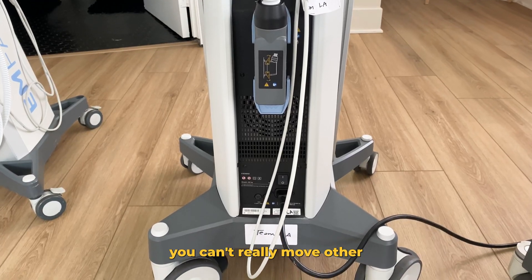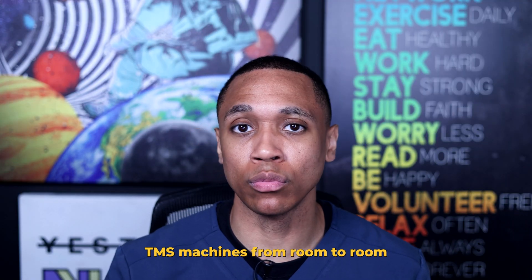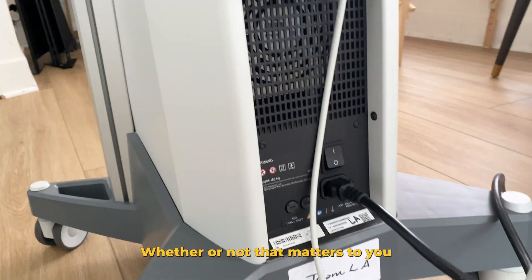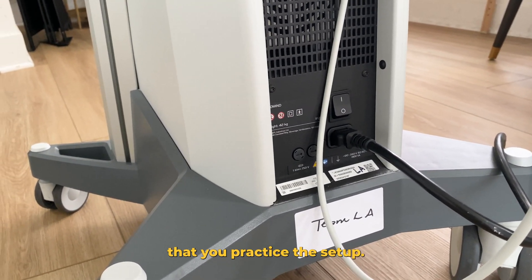In terms of portability, you can't really move other TMS machines from room to room or from office to office with ease. Now theoretically, with ExoMind, you could. Whether or not that matters to you depends on the way that your practice is set up.